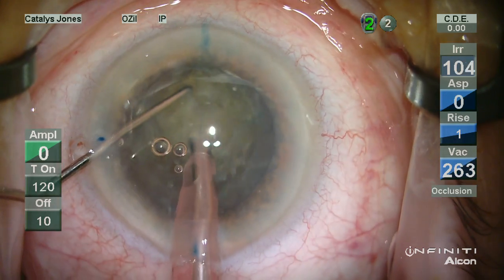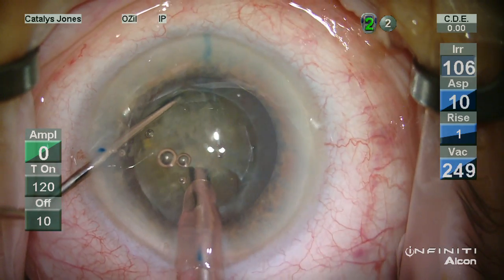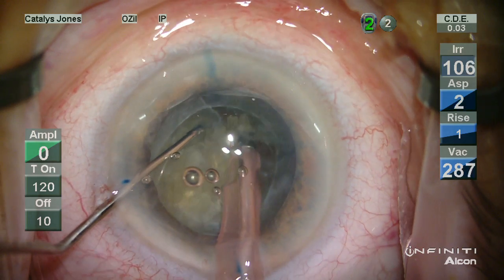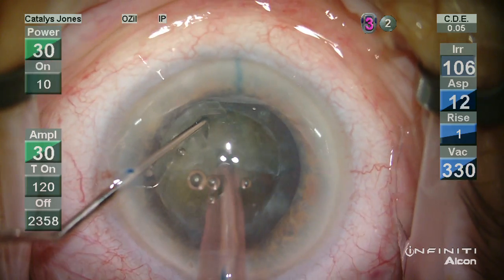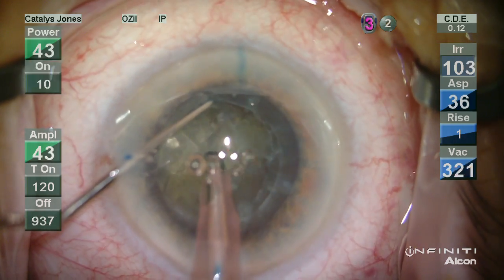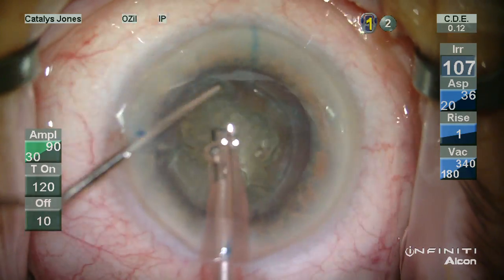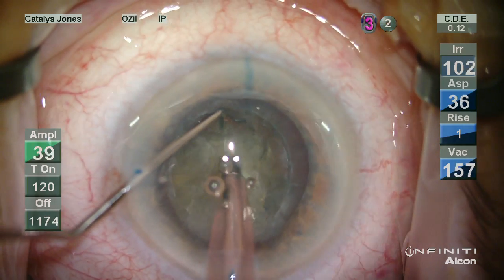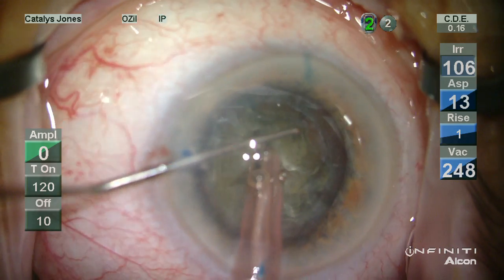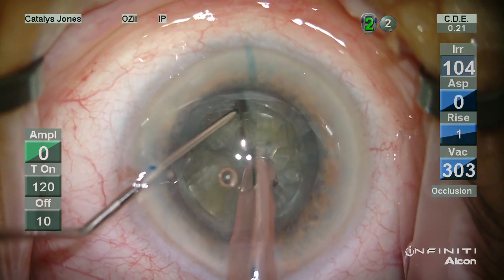This is a fairly dense cataract, approximately grade 3 nucleus. The initial chopping motions here liberate some additional gas bubbles. The hydrodissection proves very useful in maintaining a gentle rotation of the lens.